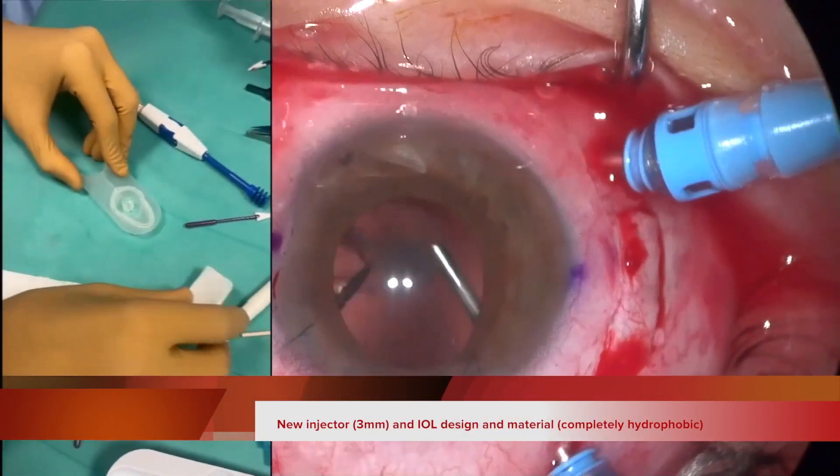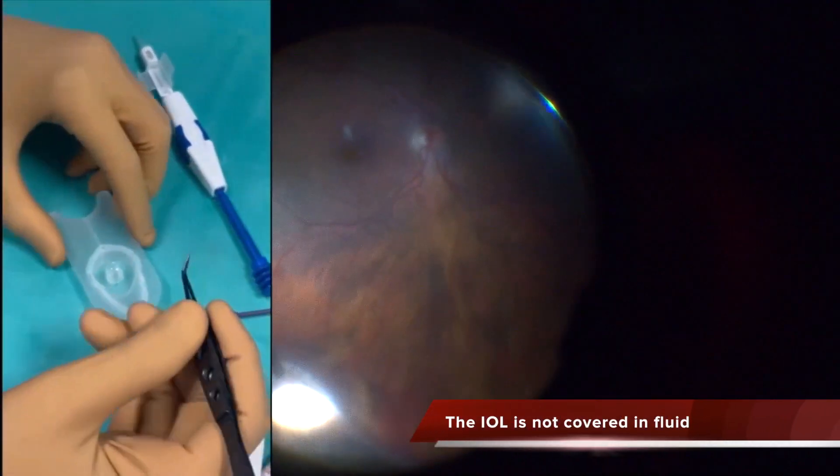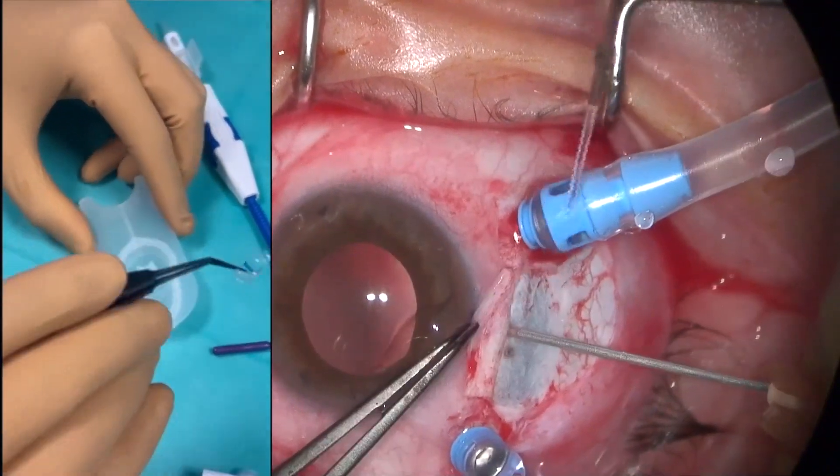This case was an aphakic eye after complicated cataract surgery. I performed complete vitrectomy inducing PVD and removed the capsular remnants. Unfortunately I created an iatrogenic retinal tear in the inferior part of the retina.